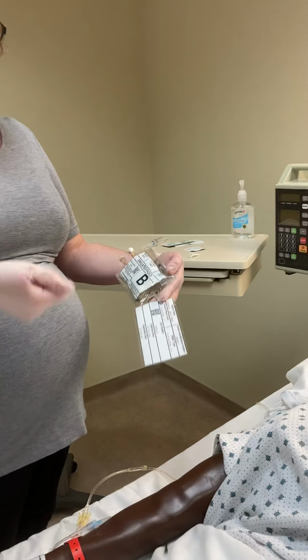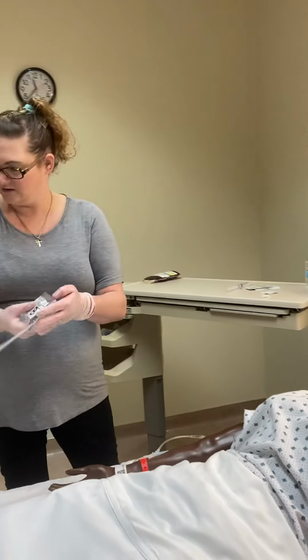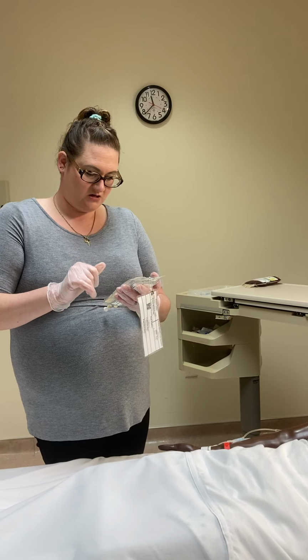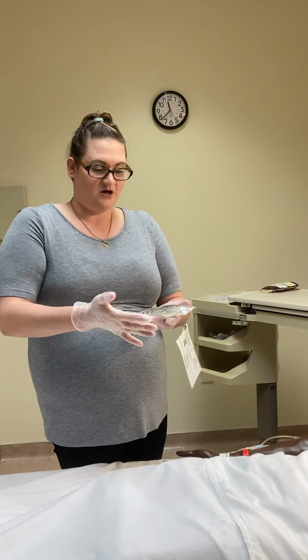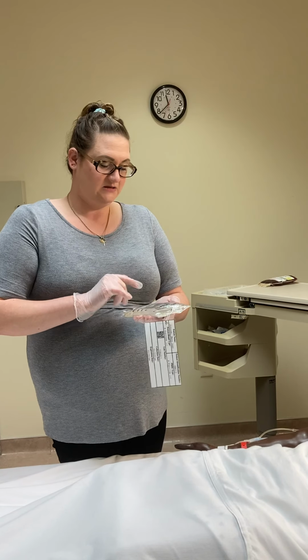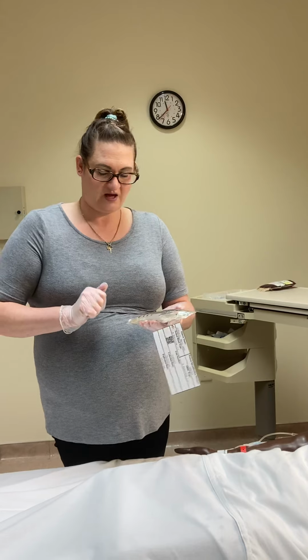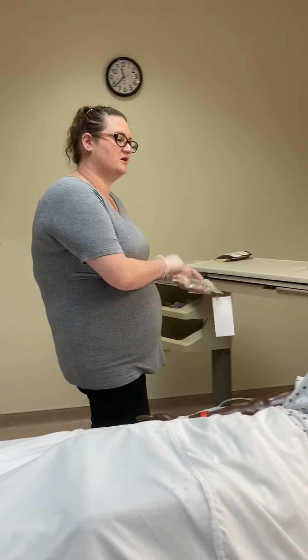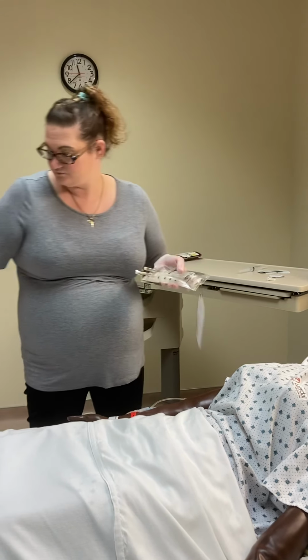So we've done those checks, we've scanned it in, everything is matching perfectly. We've looked at our bag to make sure that there's nothing contaminating it. No chunks or clumps of blood cells in there, nothing that's discolored. It should be a nice deep dark red. There shouldn't be any greenish color or anything that could be contaminated. Again, it's not expired. There's no leaking or anything. We've already compared everything. We did our hand hygiene and we have got the gloves on. And we've already prepared our line.